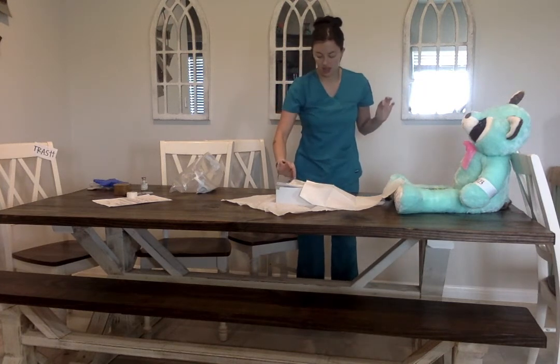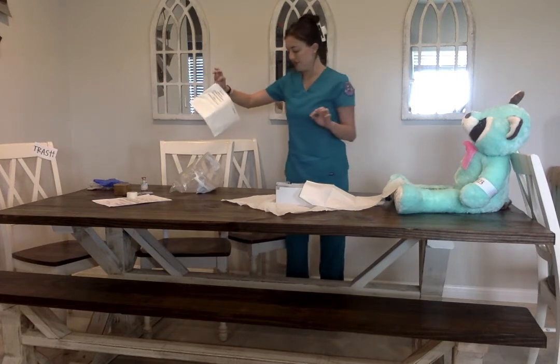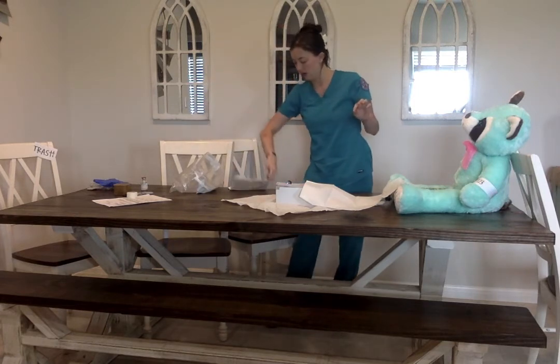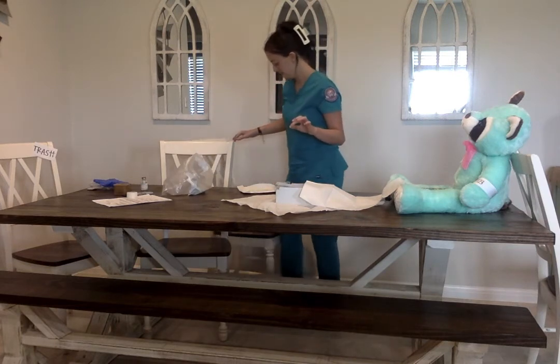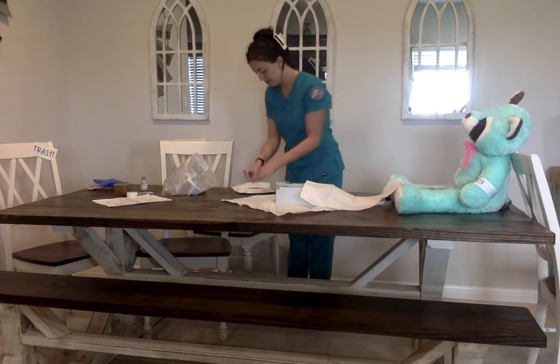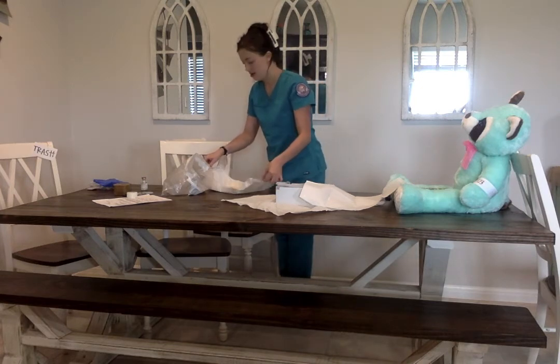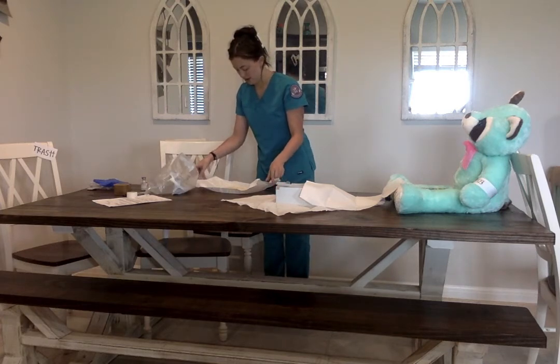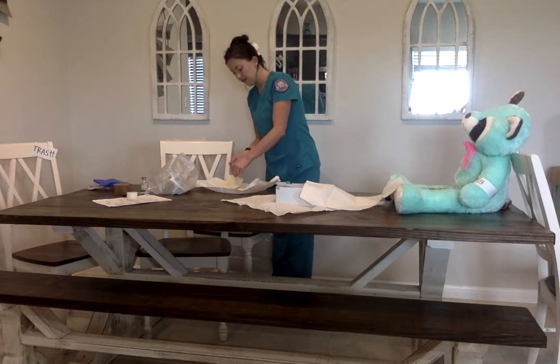Now I'm going to get the sterile gloves. You can see this. Lay that down. Touching the outer edges of this. Okay. Now touching only the folded cuff.